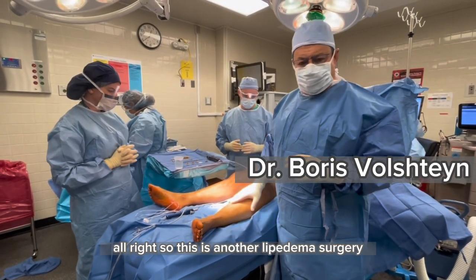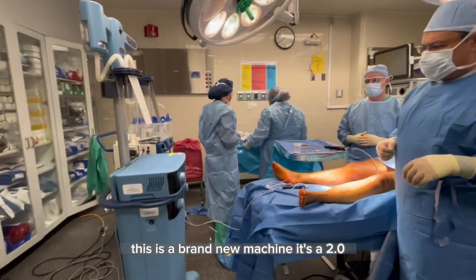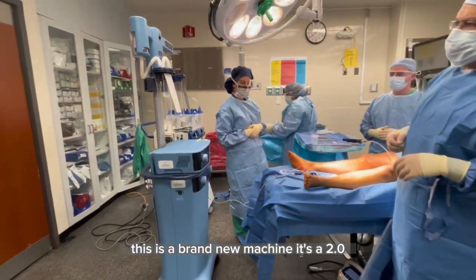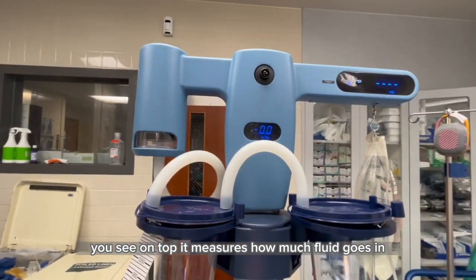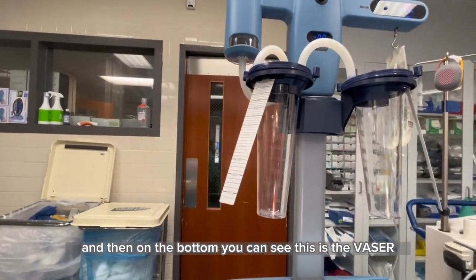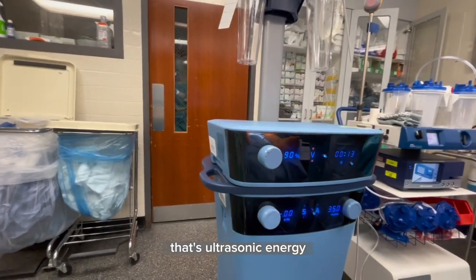This is another lipidema surgery, and we have the new VASER. This is a brand new machine — it's a 2.0. You can see on top it measures how much fluid goes in and how much fat comes out. On the bottom you can see this is the VASER — that's ultrasonic energy.